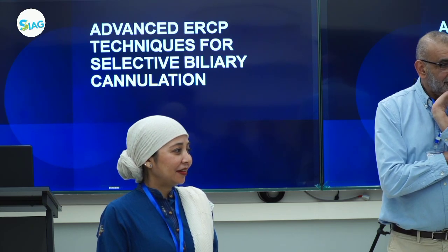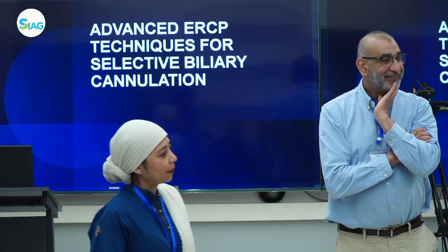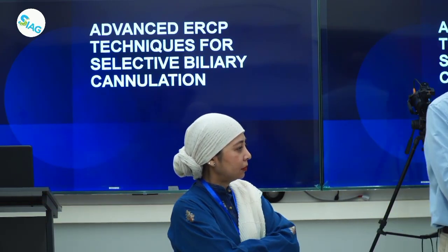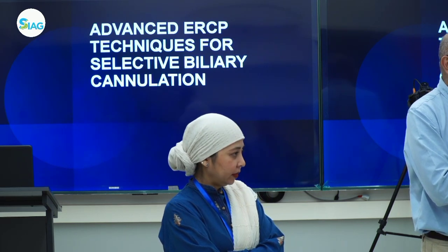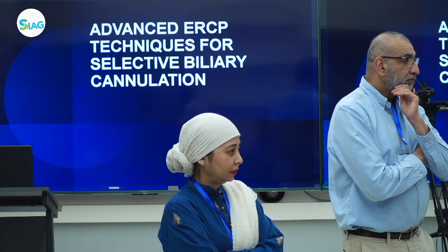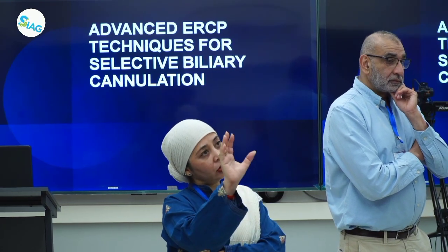प्रैक्टिकली भी हम ये कर रहे हैं. पहले हमने लर्न की है वक्त के साथ साथ. पहले मैं एक शॉट लेता हूँ, उसके फ्लोरोस्कोपी पे अपनी स्कोप की पोजीशन को चेक करूँगा. उसके बाद मैं जो एम्पुला है उसको फिर प्रॉपर्ली ऑब्जर्व करता हूँ. इस स्फिंक्टर के साथ ऊपर नीचे करके उसकी पोजीशन चेक करता हूँ.